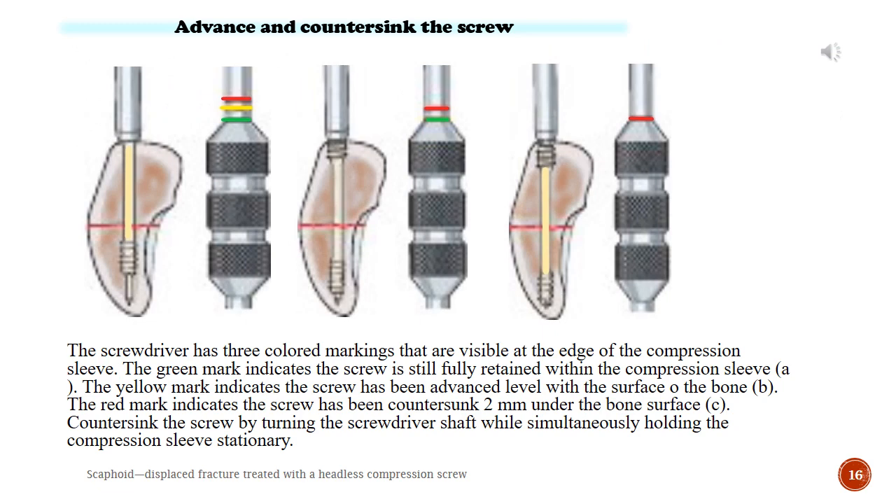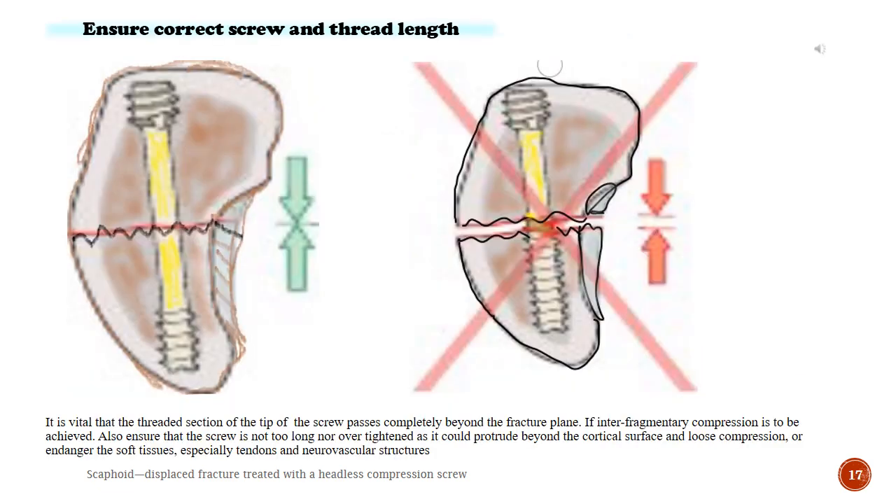Advance and countersink the screw. The screwdriver has three colored markings visible at the edge of the compression sleeve. The green mark indicates the screw is still fully retained within the compression sleeve. The yellow mark indicates the screw has been advanced level with the surface of the bone. The red mark indicates the screw has been countersunk 2 mm under the bone surface. Countersink the screw by turning the screwdriver shaft while simultaneously holding the compression sleeve stationary. It is vital that the threaded section of the tip of the screw passes completely beyond the fracture plane if inter-fragmentary compression is to be achieved. Also ensure that the screw is not too long nor over-tightened, as it could protrude beyond the cortical surface and lose compression, or endanger the soft tissues, especially tendons and neurovascular structures.